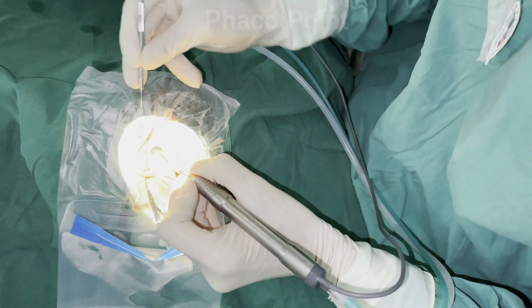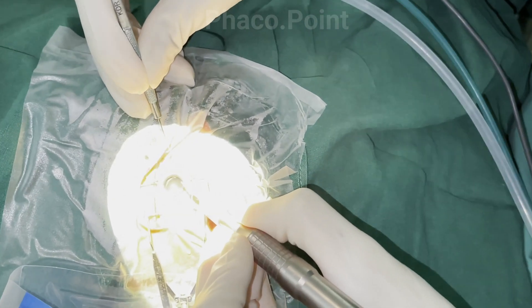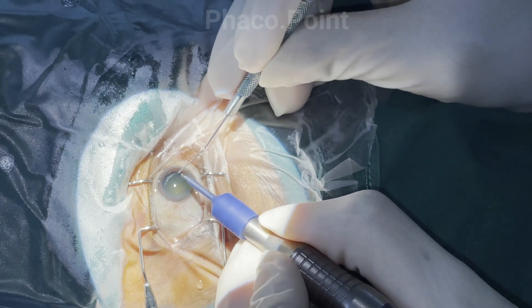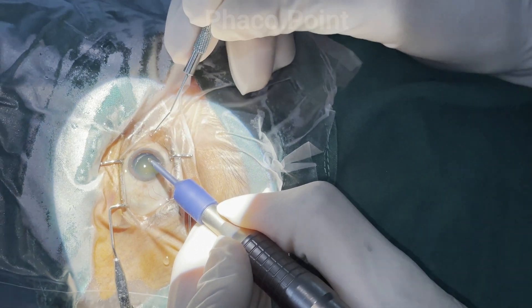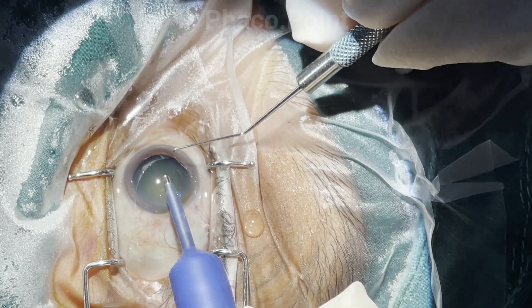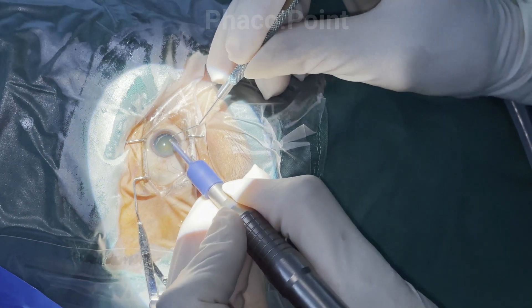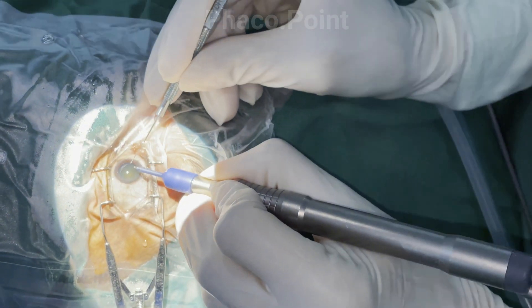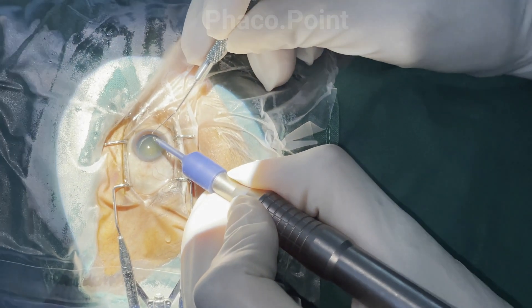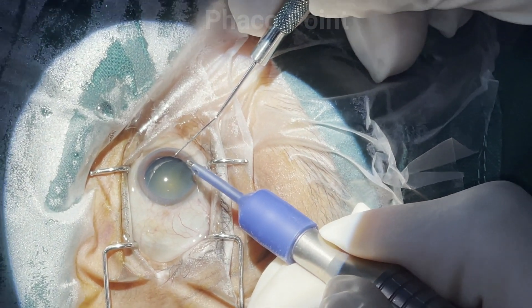If the side port incision is made too far from the main incision, it creates an awkward operating position. The comfortable distance between the main incision for the phaco probe and the side port incision for the second instrument should be roughly 90 degrees apart. This angle should be maintained regardless of where the main incision is placed, to aid the ease of the nuclear emulsification procedure.